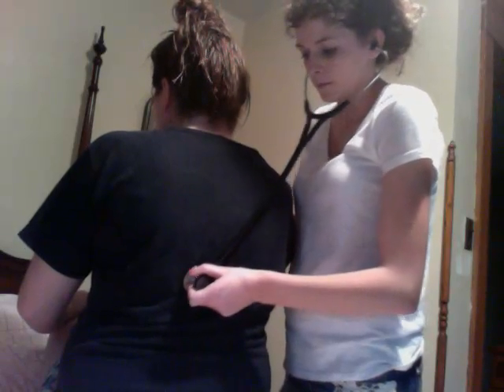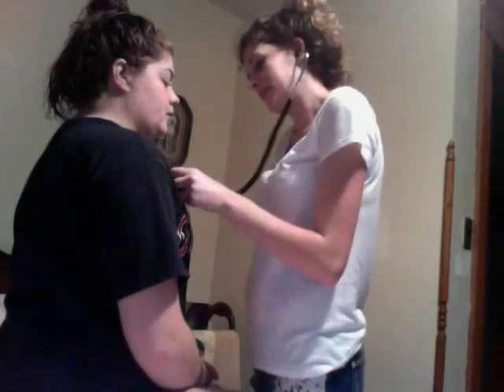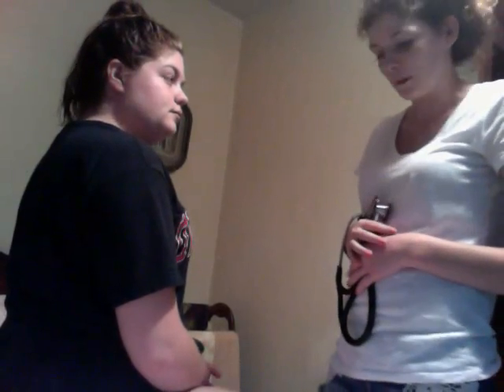One more time. And her lungs are clear, no adventitious breath sounds are noted. And then I would move on to the anterior chest. I would do the same thing, assessing respirations, any bumps, lumps, that kind of thing. No lesions. And then I would auscultate the front of her chest. Just have you take a couple more deep breaths. Once again, her lung sounds are clear. No abnormal lung sounds are noted.